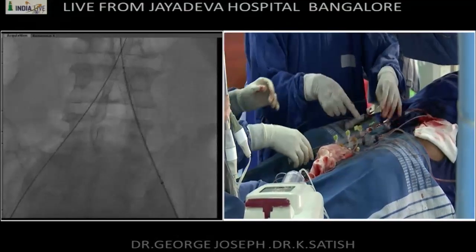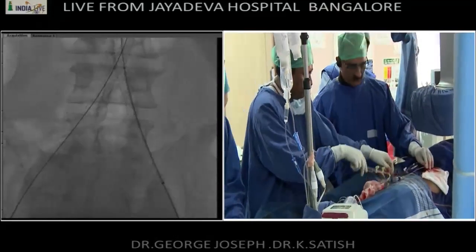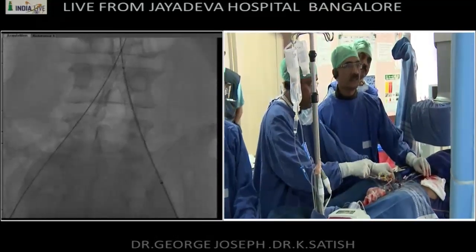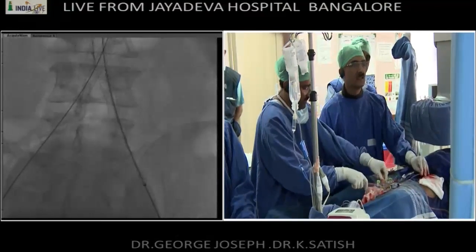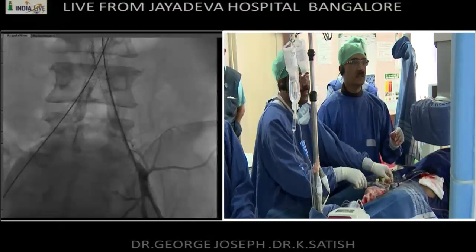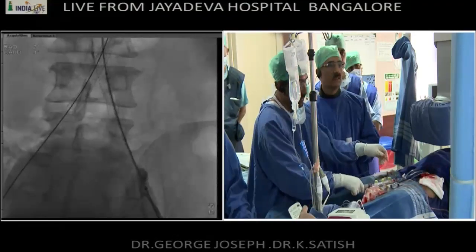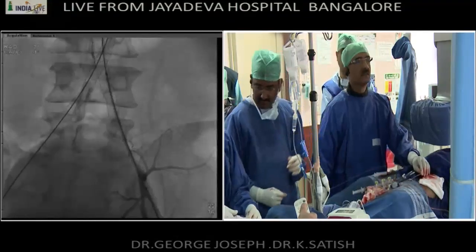Now just take a picture from below. Ready to shoot? Free the table a little bit, shift a little to the left side. Okay. So Dr. Khanna, I'm just taking a picture on the left side. Do a proximal optimization of the aortic stent end? Yeah, we can do this. You want to go 1 millimeter up or what?